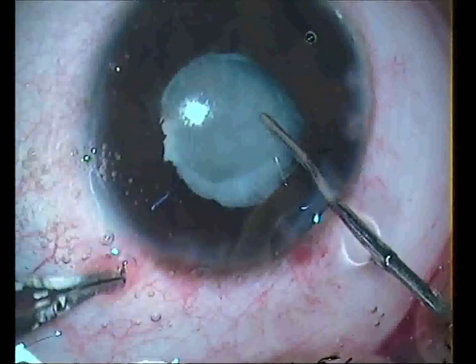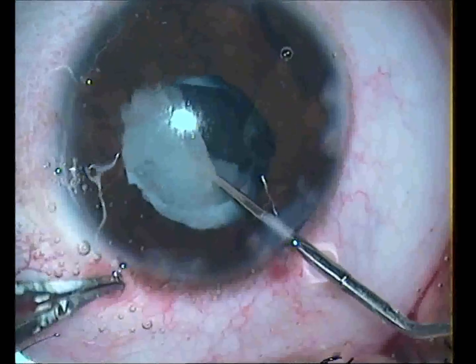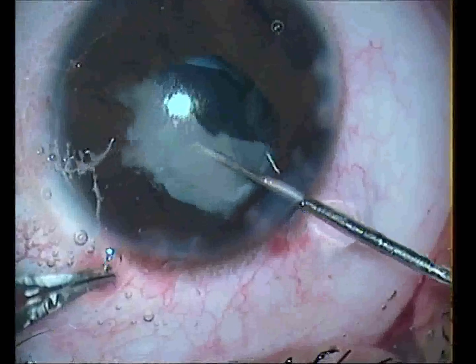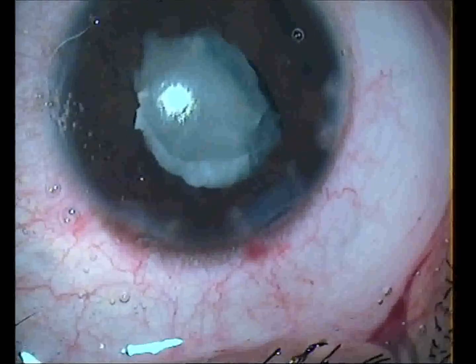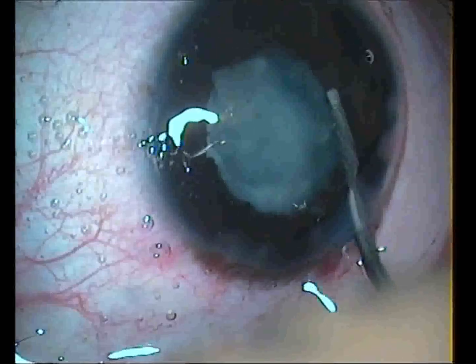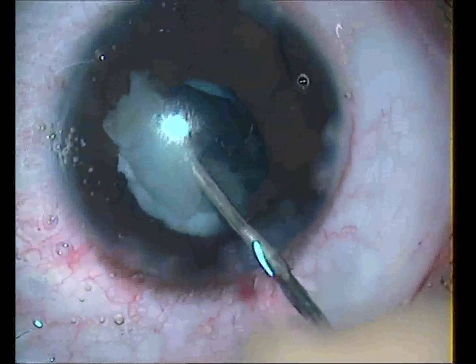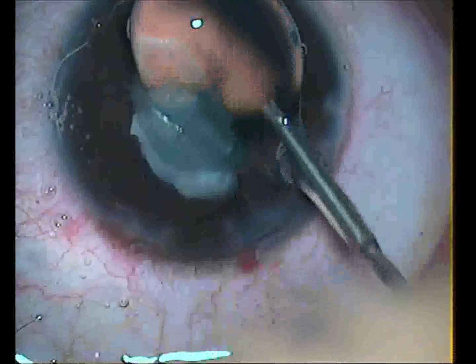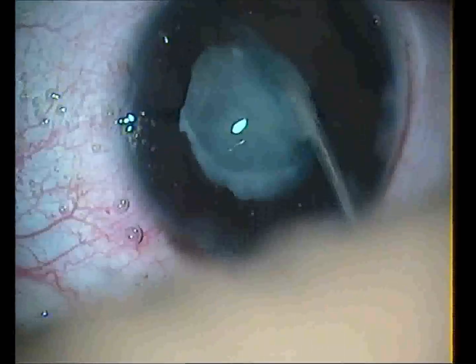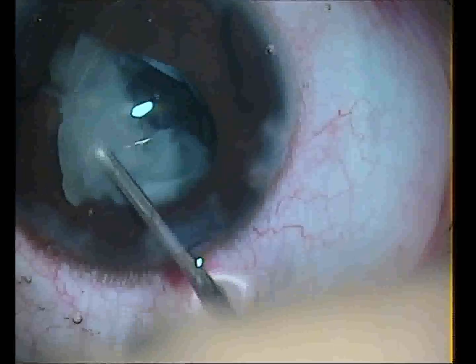Then later on you can try to remove the soft nucleus, but while removing the soft nuclear material I found that there could be a rent behind it. So the next challenge was to remove this nuclear fragment or the soft nucleus from the bag itself without disturbing much of the vitreous.